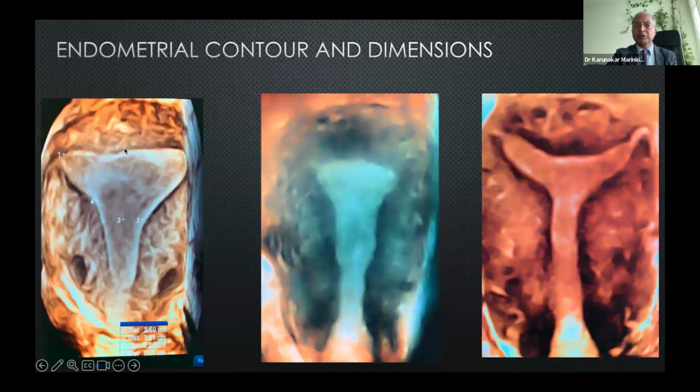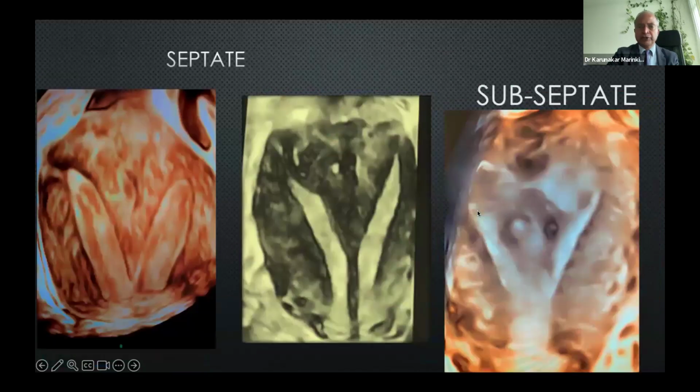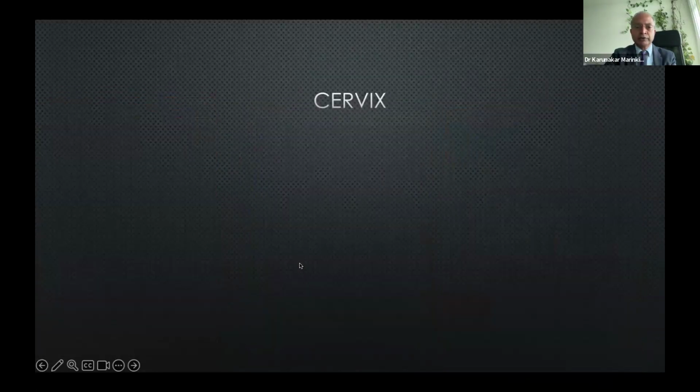Again, endometrial cavity can be a wide V shape in a multiparous. You can see the 2 uterine arteries here. It can be a bit cylindrical or it can be T-shaped. When you do septolysis, sometimes it's not always possible to remove the whole septum. You can do in 2 stages. You can bring the complete septum to large subseptum and then subseptum, small septum. And as long as the implantation doesn't take place on the scarred sclerotic area secondary to your diathermy surgery, she will get away and she'll be very thankful to you.